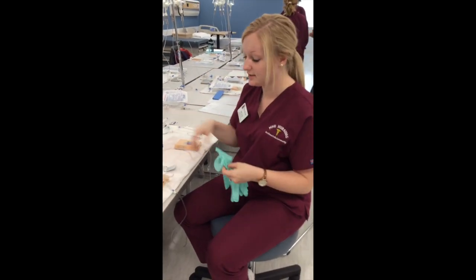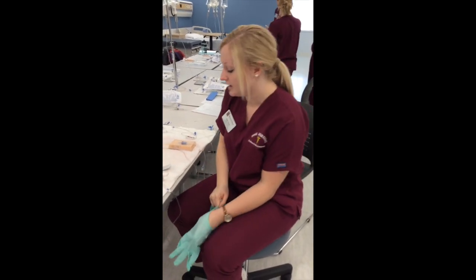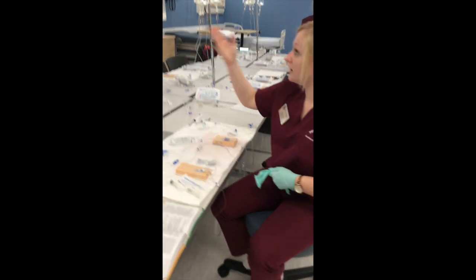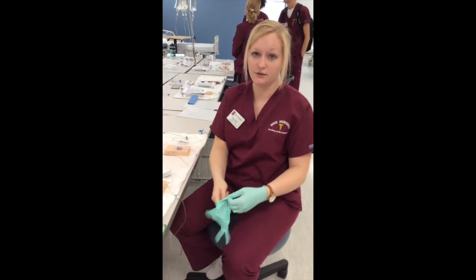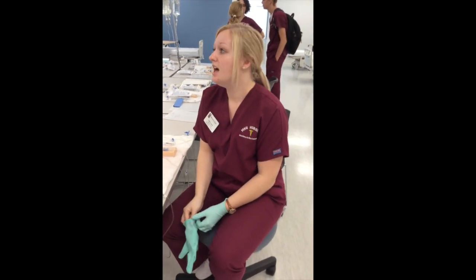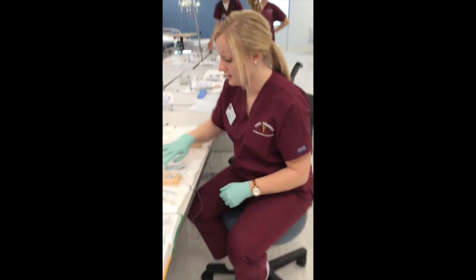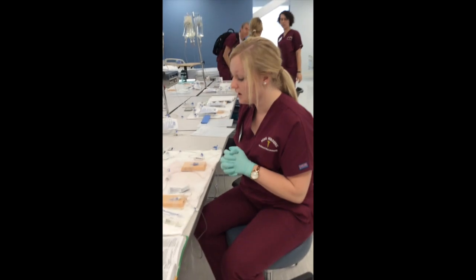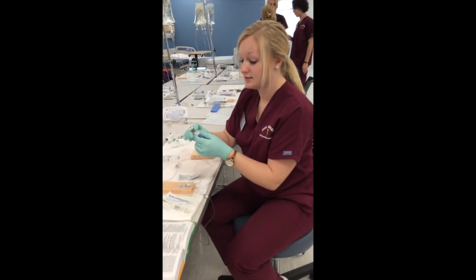So I'm going to go ahead and let the patient know I'm going to start their infusion. I've got my supplies, I'm going to perform hand hygiene and put gloves on. I'm going to check their IV site and make sure that it's patent. I see that they already have sodium chloride infusing, and that's something that I noted on their MAR when I was getting the medication out of the cabinet, and it is compatible, so that's good. I'm going to make sure there's no infiltration or anything at the IV site. So I'm going to get my medication and check for the second time, yes, morphine.